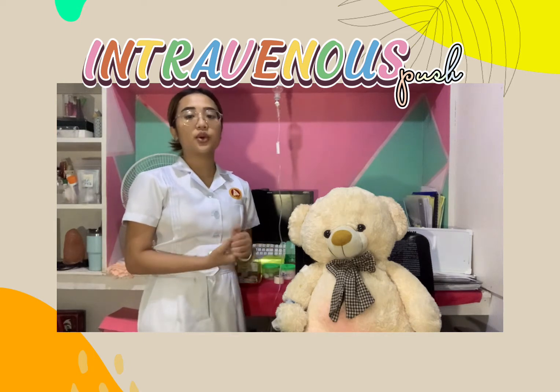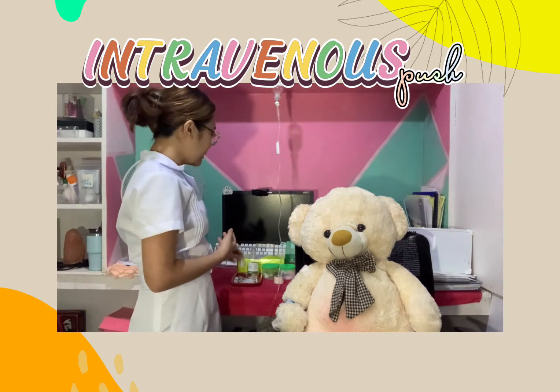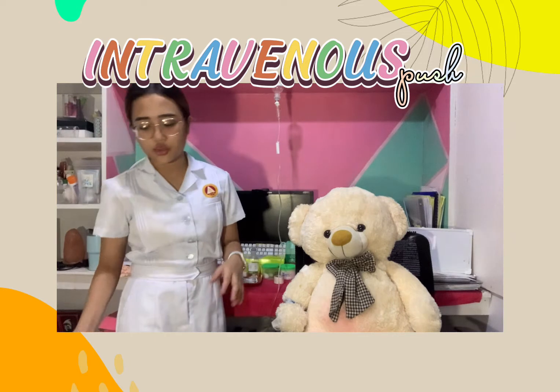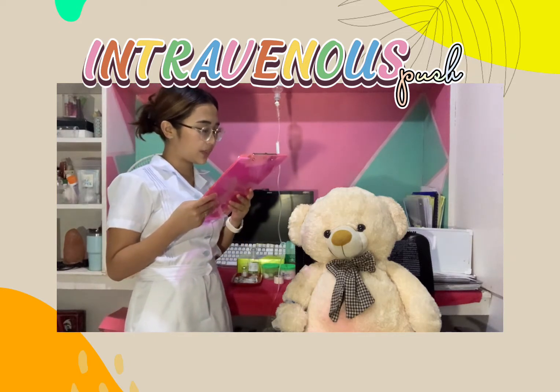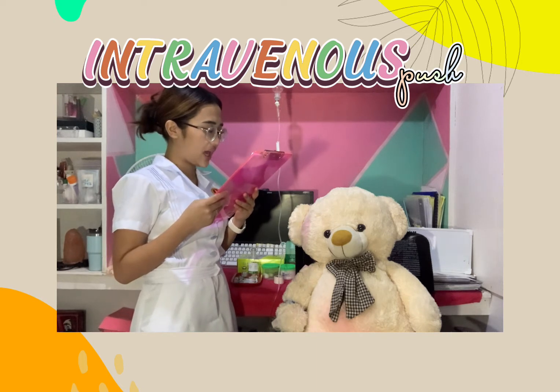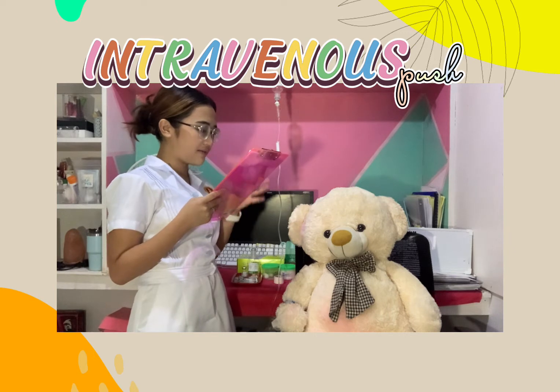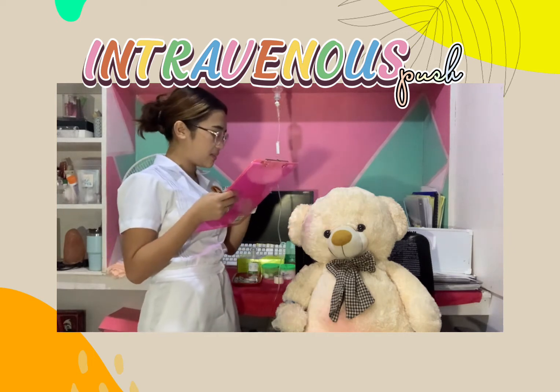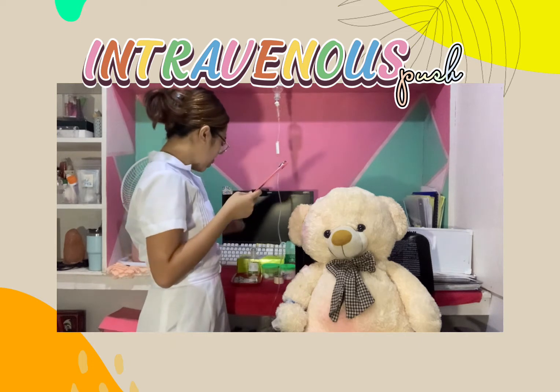After that, we will now make sure to check the medication against the MAR of the patient. So we will check the MAR of the patient. As per order, the patient will be having paracetamol for IV push. We will check the label of the medicine. Paracetamol, expiration date is on January 1, 2022.